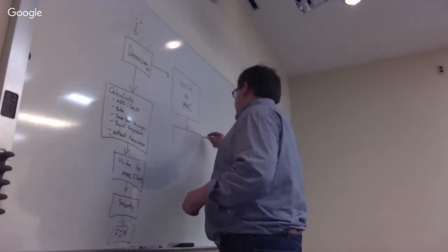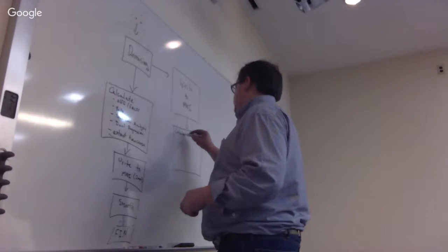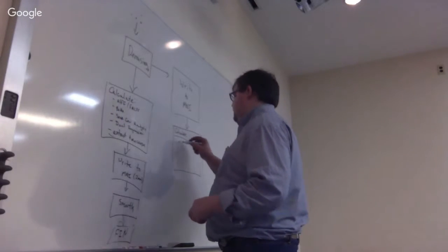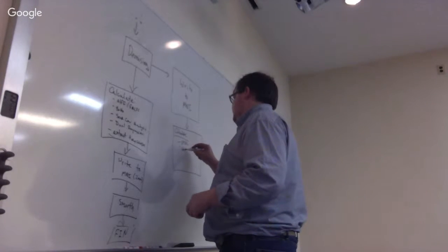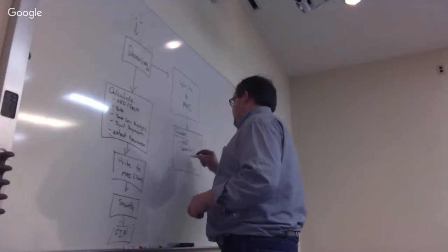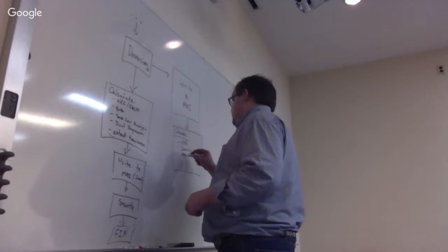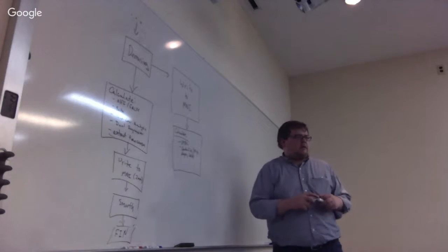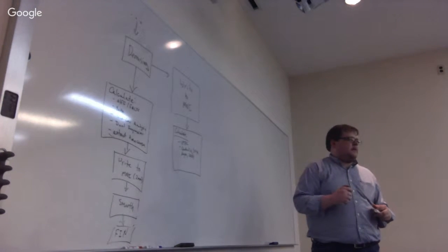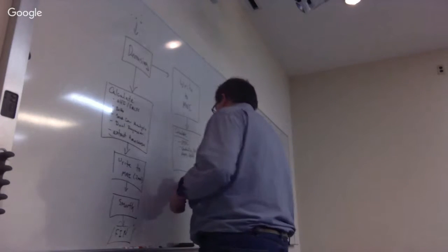Then we calculate. So these would be VMHC, centrality, and in centrality here I'm including eigenvector, degree, and LFCD. Is there anything else that's calculated? Right? And then the results of that are smoothed.